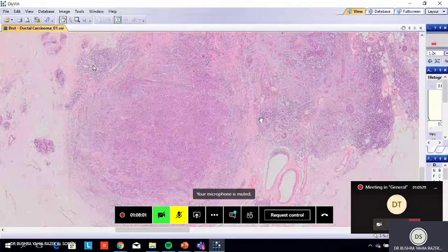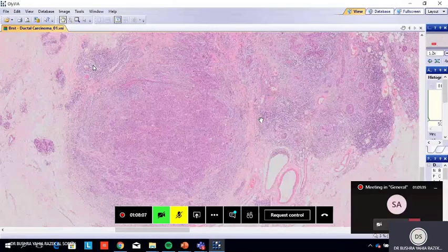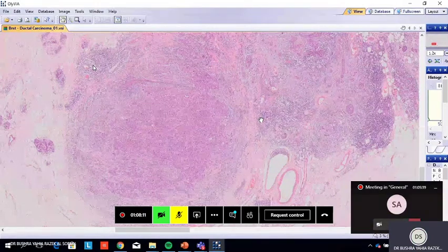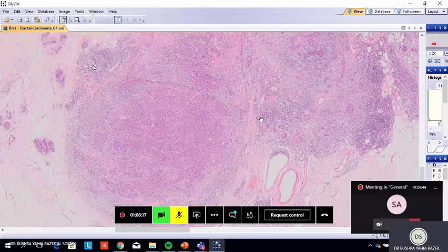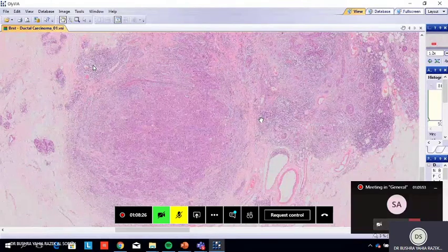Yes. Doctor, can you say pleomorphic cells as well for this one? And then the features of malignancy. The features of malignancy are the cytological changes: pleomorphism, hyperchromasia, mitosis, irregular nuclei, all these things. But in fibroadenoma, we don't have all these things.